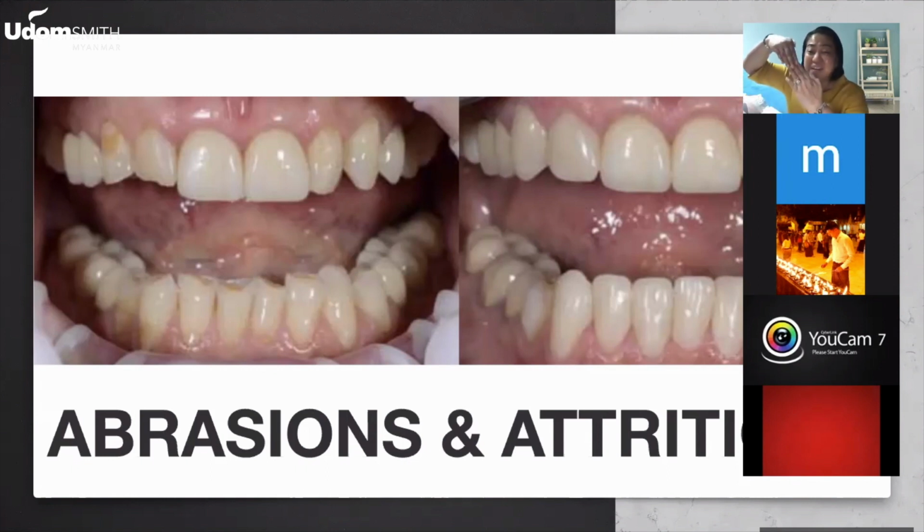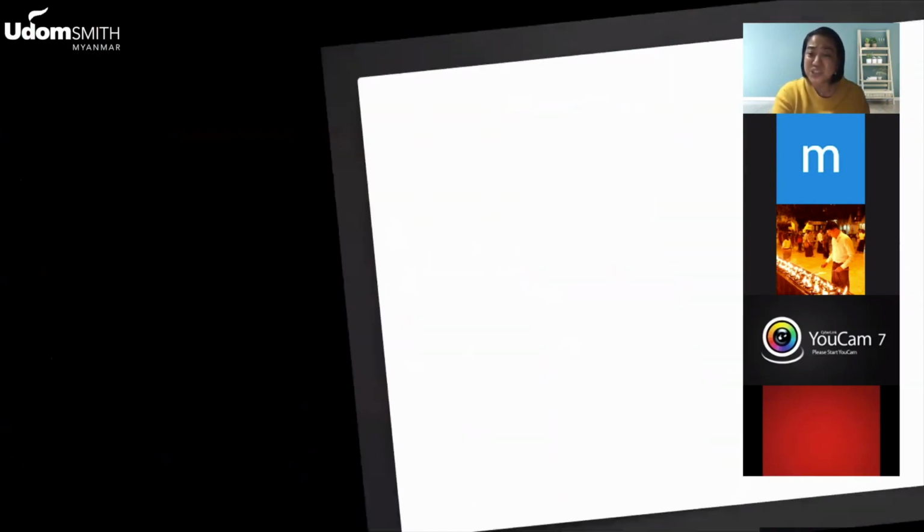Plus, there is a difference in terms of solidification of the material with your tooth structure. Since Edelweiss is created in a factory and is already solidified, it acts as one unit that you cement on the tooth. So its capacity to absorb the force and last longer has a higher possibility than direct restoration.